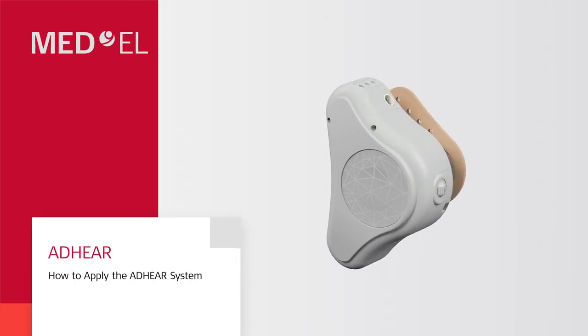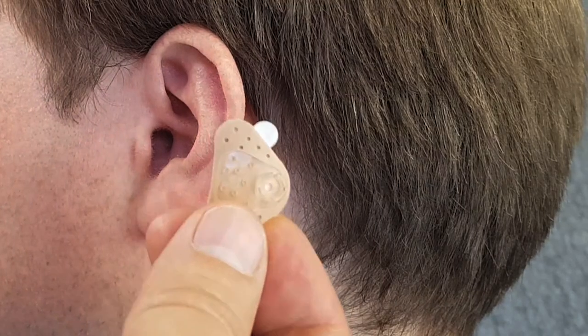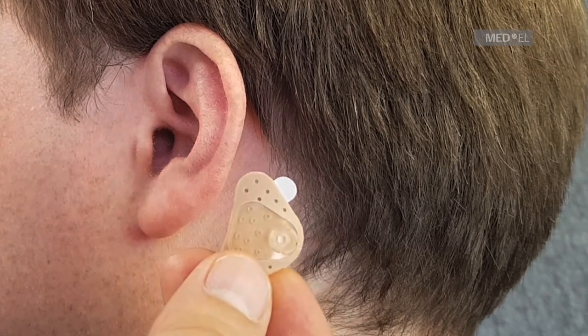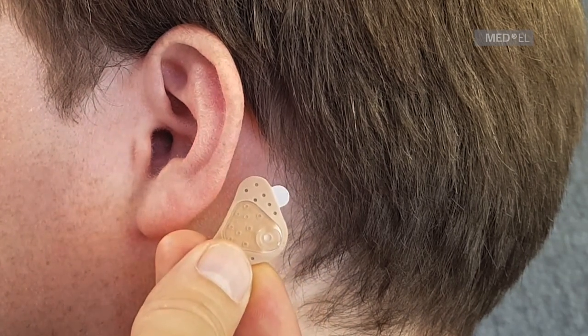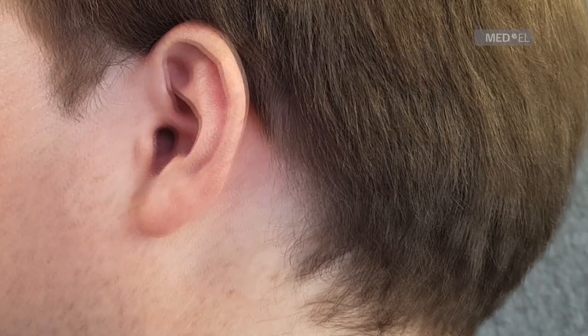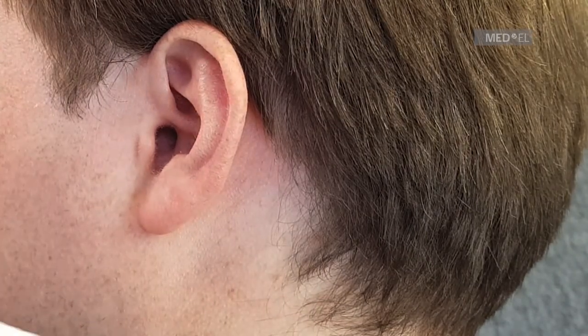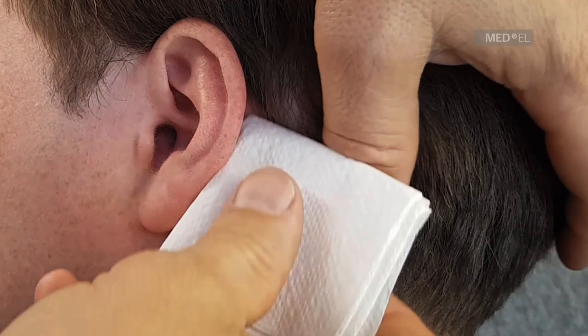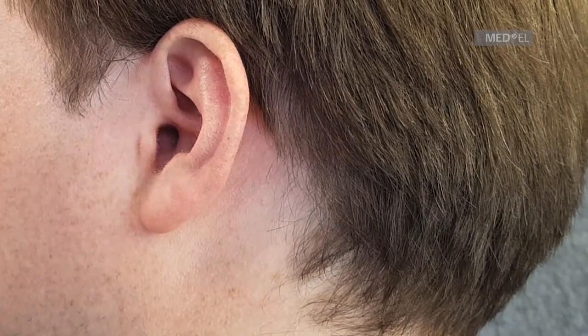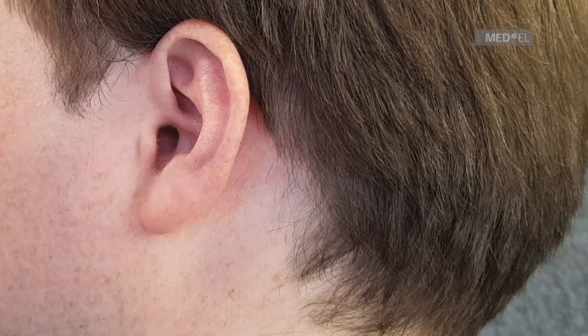In this video, you will learn how to apply the Adhere system. First, make sure the hairless area of skin behind the ear is big enough for the adhesive adapter. If it isn't big enough, adjust the hairline with a razor. The skin must be clean and dry before you apply the adhesive adapter. Clean the skin thoroughly and let it dry completely before you start.